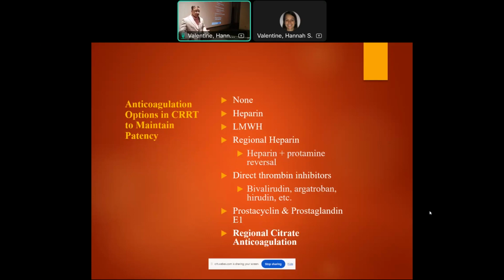Okay, so the first question is, why the heck do we need any anticoagulation, right? Why do we need it? Exactly. It's so interesting. There's a concept of prescribed dose. I can prescribe whatever dose I want, but that ain't going to be the delivered dose, right? So let me ask you this. And we may have discussed this on rounds, but off the prescribed dose, what's the percentage of the dose that's really delivered for CRRT? Any idea? Just throw any. 70%. Close. Very close. It's about 64%.